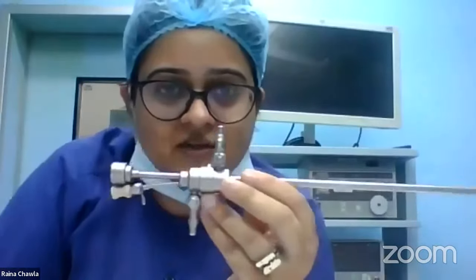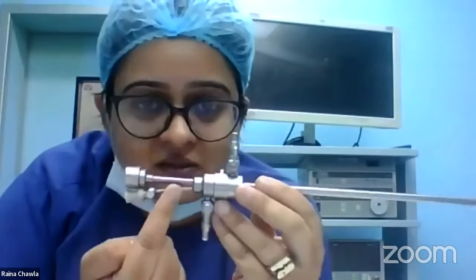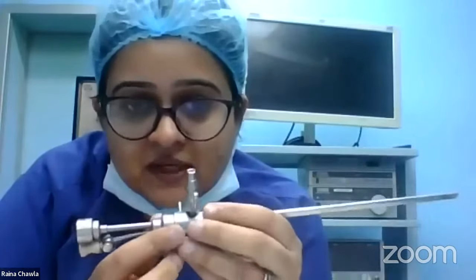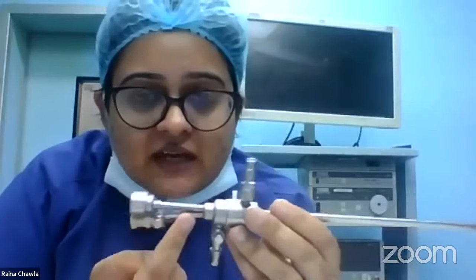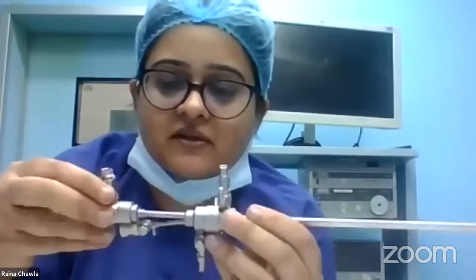This was a laparoscope, so the thing is the same. With the hysteroscope, the only thing is we have the sheath. We have an inner sheath and an outer sheath. This is an operative hysteroscope. Why is it an operative hysteroscope? Because it has this operating channel. The gold standard for endometrial biopsy is a hysteroscopic guided biopsy. So this is the channel for introducing instruments. This is how the hysteroscope is attached.